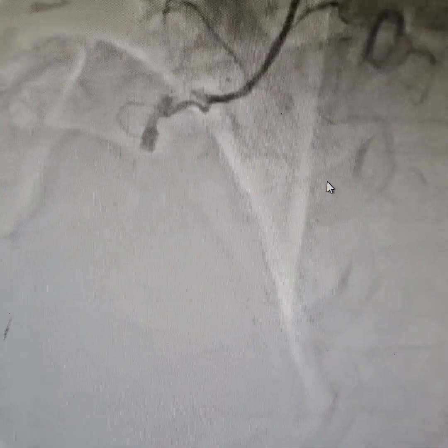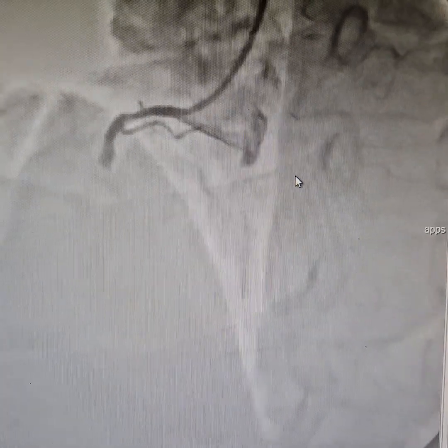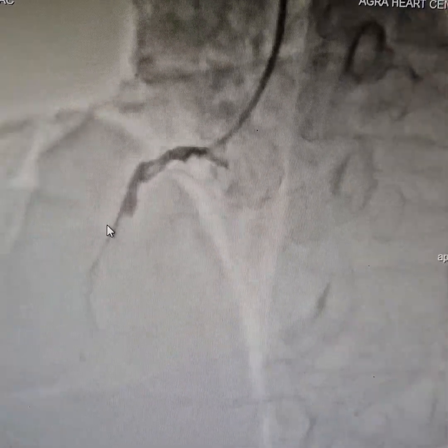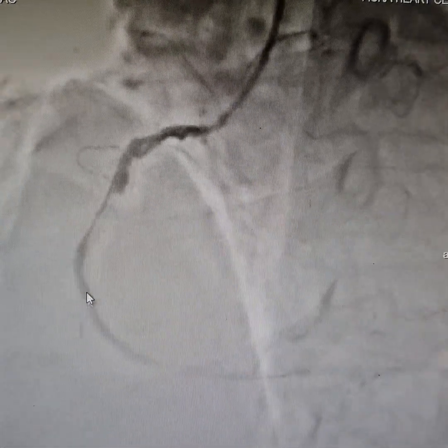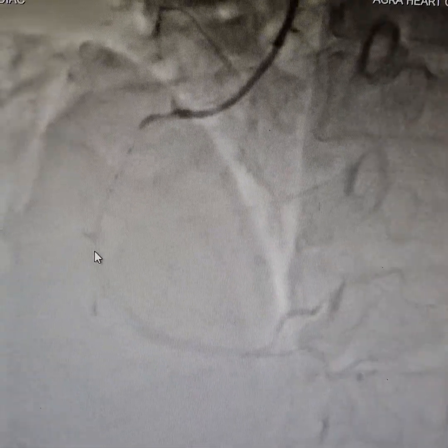At this point you have to remember that you have to keep at it. Sometimes it takes 4, 5, or even 6 or 7 passes of thrombus aspiration to actually do some work. After the thrombus aspiration we did some pre-dilation, and now you can see that the flow has been slowly restored. You can see that this is the area with thrombus.